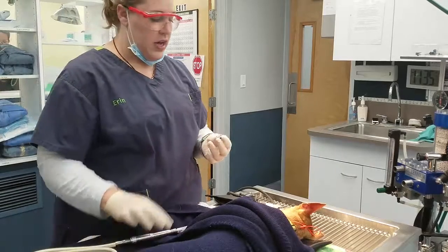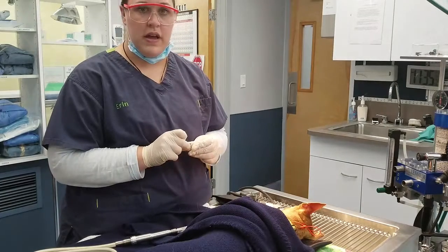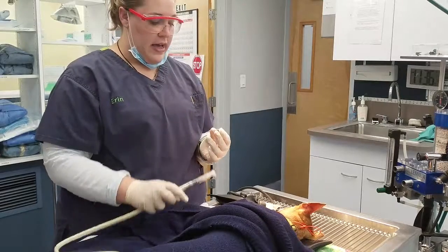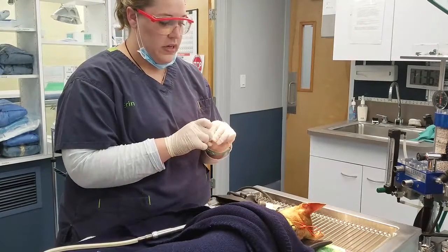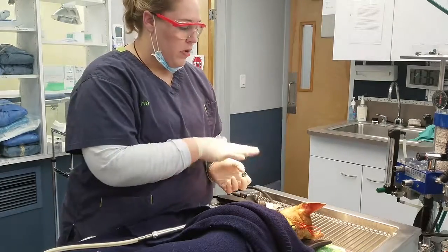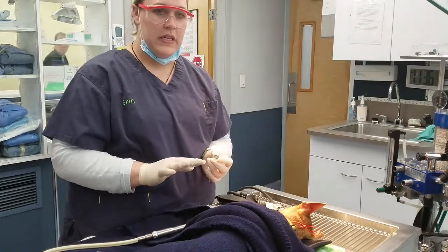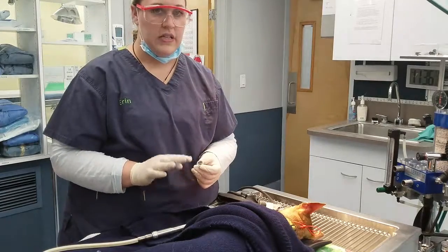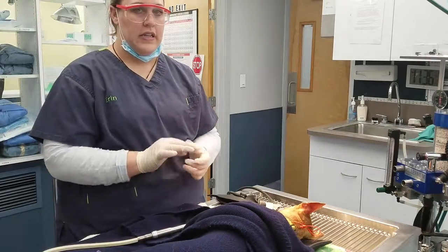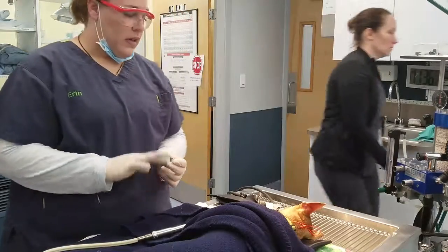So when we polish teeth after we've finished all of our treatments for cleaning, polishing, x-raying, extractions, any of that, we're going to take our Prophy polish and a Prophy head, and apply it to each tooth, spending about 2 to 3 seconds at about 3,000 RPM on each tooth. The purpose of the polish is to seal any cracks, smooth out any crevices, and also remove any remaining stains off of the teeth, as a nice finishing touch, and seal the tooth over at the end of the dentistry. So I'm going to go ahead and seal this side over and clean it up.